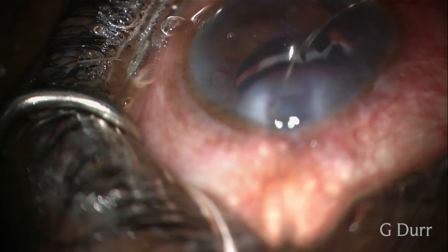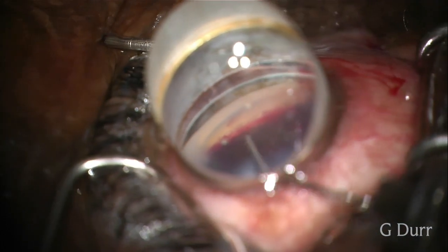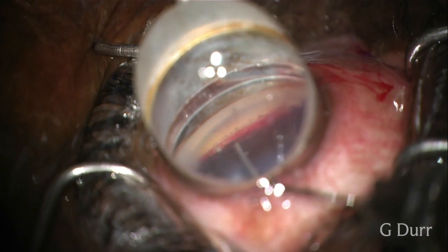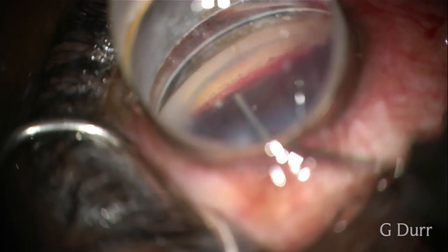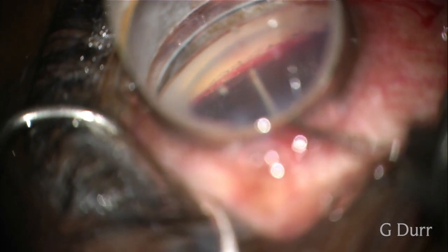So here we got about 180 degrees that's done. And then we're going to inject some viscoelastic here to show the cleft that we just created. And we see the back wall there of Schlemm's canal quite nicely here.